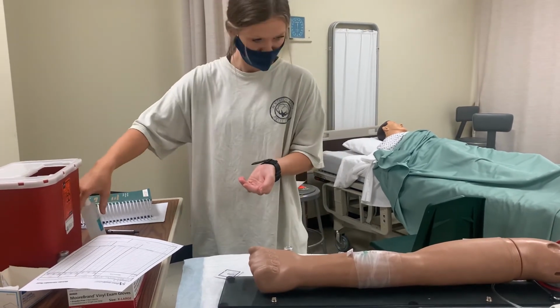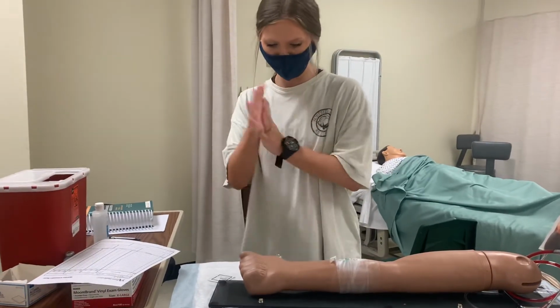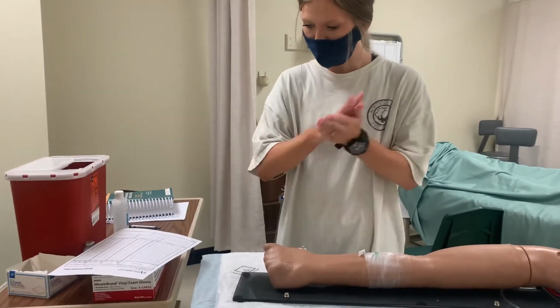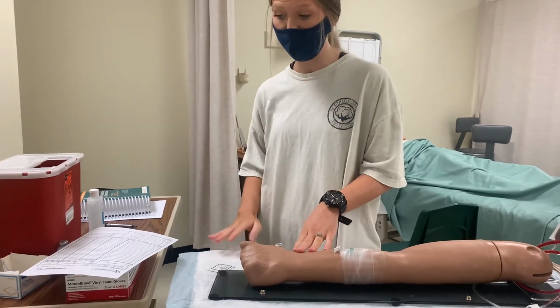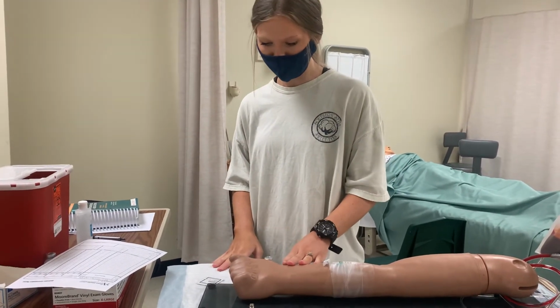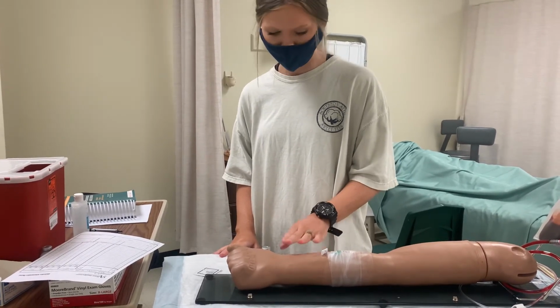I put my medication to the side while I identify the patient. Can you please tell me your name and date of birth? He tells me his name is John Smith. His birthday is March 23rd, 1991. Do you have any allergies, Mr. Smith? He doesn't have any allergies.